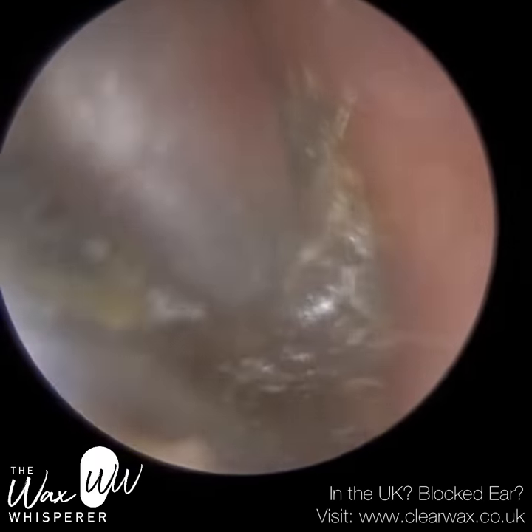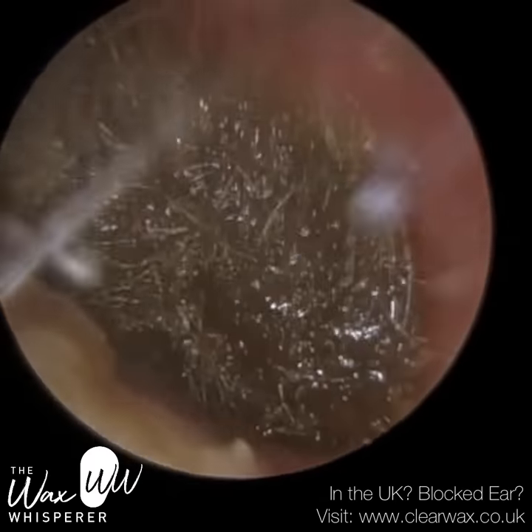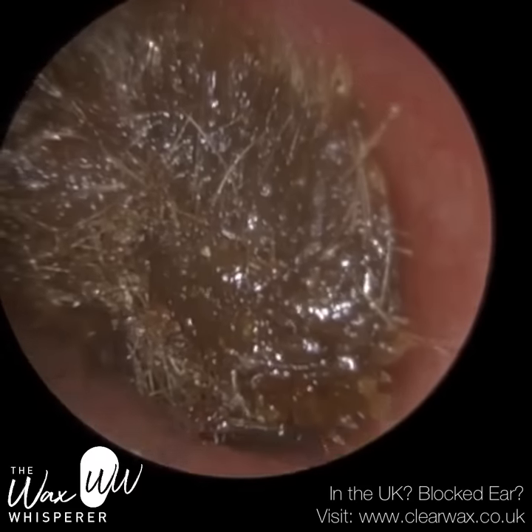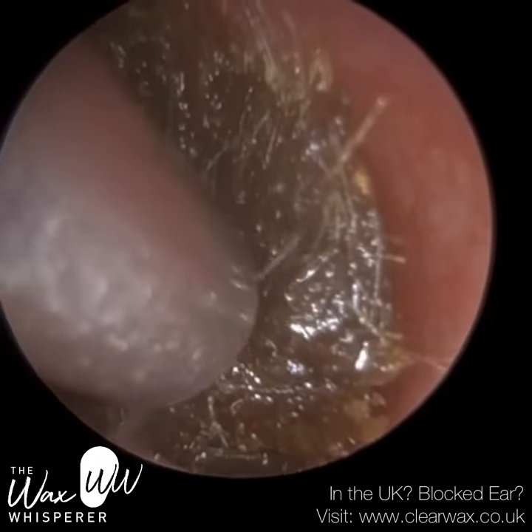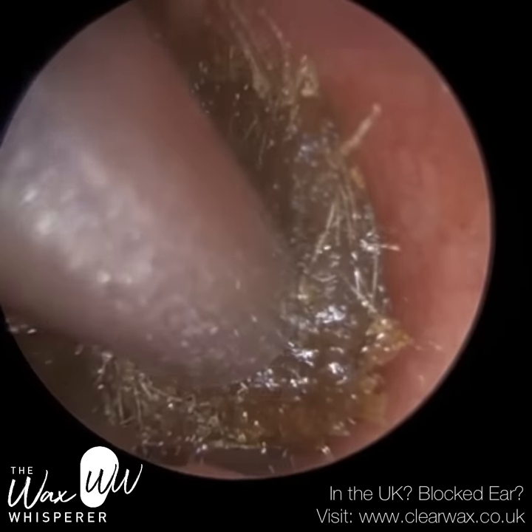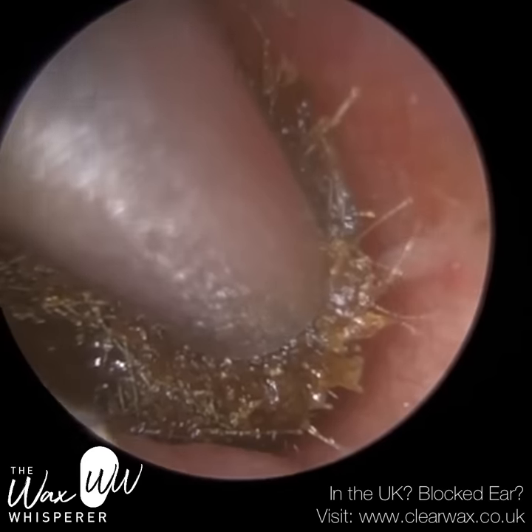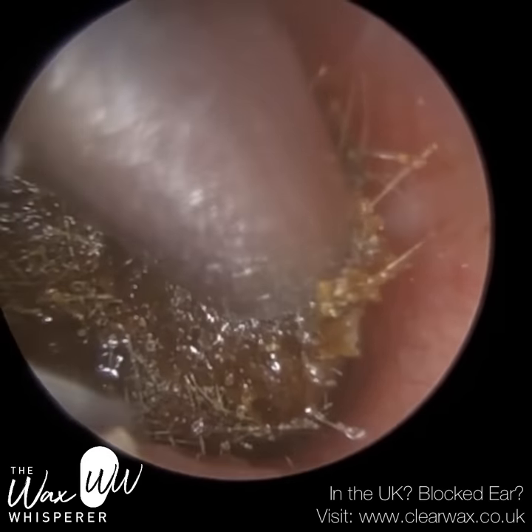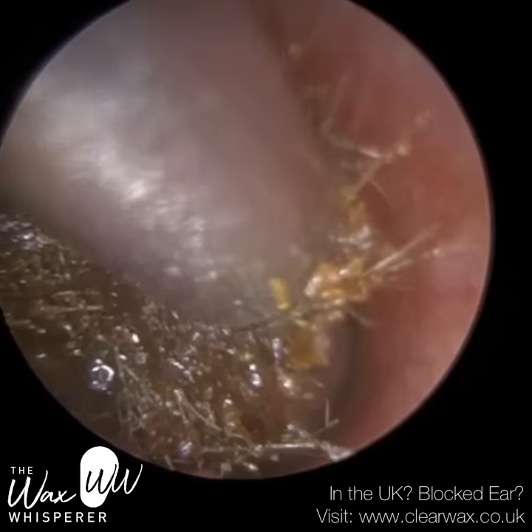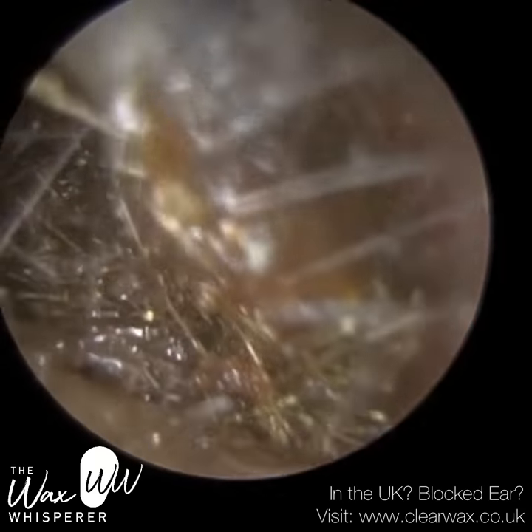I've decided to go in the middle. You can see it's slightly blurry — that's because I'm performing the procedure while the oil is in situ; I find that works a bit better. When you've got oil in the ear and you're suctioning, some of that oil is being vacuumed and glazing the tip of the endoscope lens as it travels up the suction probe. I can feel that I've got a suction grip and I don't want to let go. You can see the wax plug moving out of the isthmus.